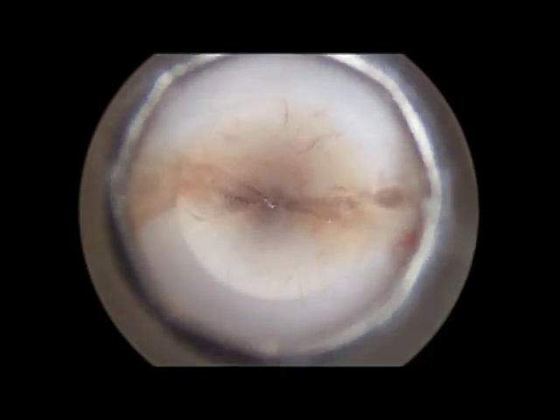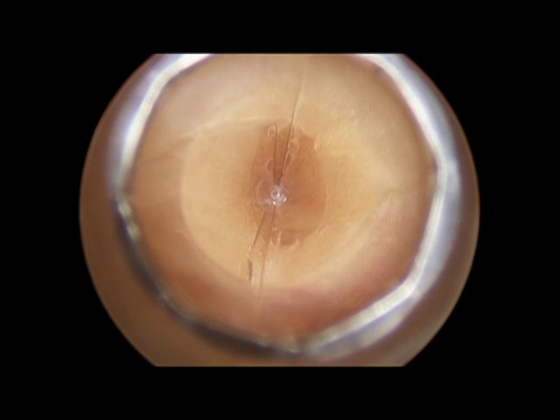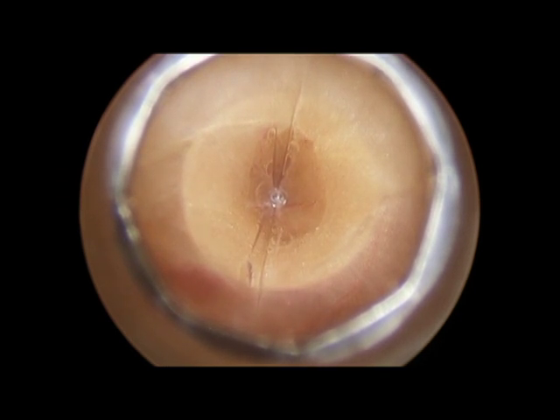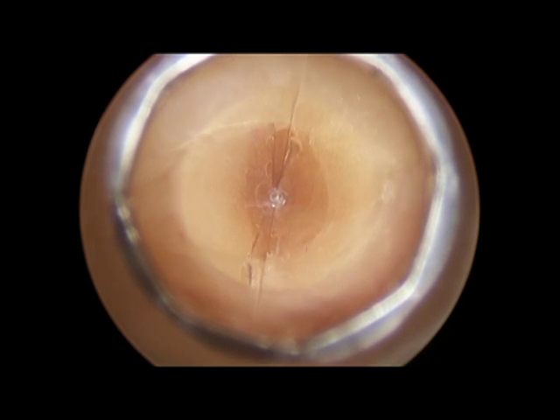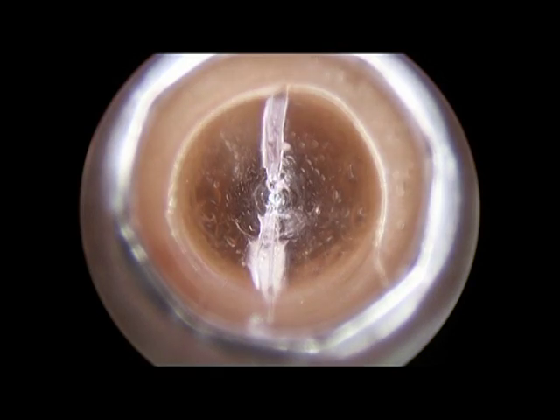Finally, the yellow preperitoneal fat and the peritoneum itself are entered. At this point, the trocar is in the peritoneal cavity and insufflation of carbon dioxide can begin safely.